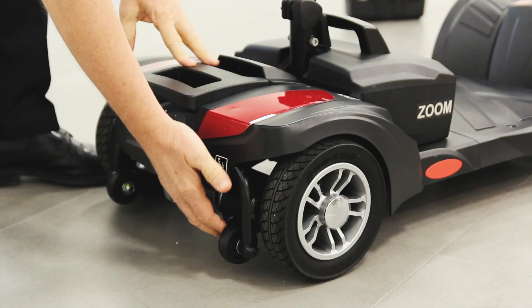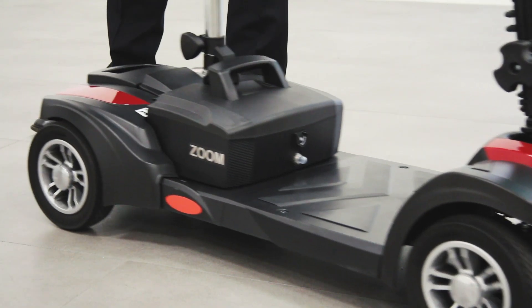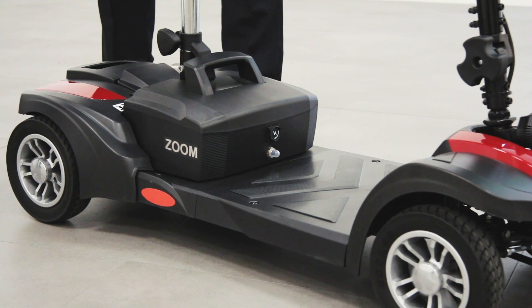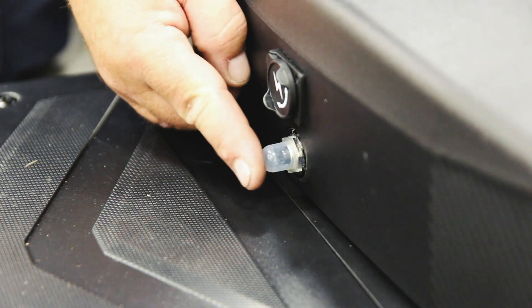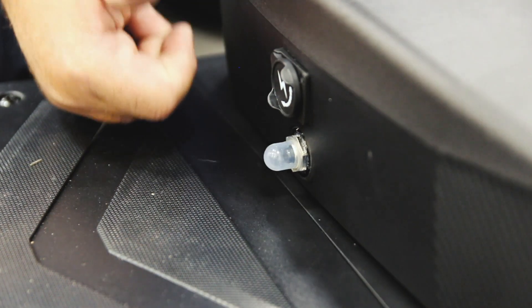The free wheel lever lets you move the scooter when it's not switched on. You'll find the lever at the rear of the scooter. The free wheel lever must be in the drive position before starting the scooter. The circuit breaker or reset button can be found on the battery box below the charging port.